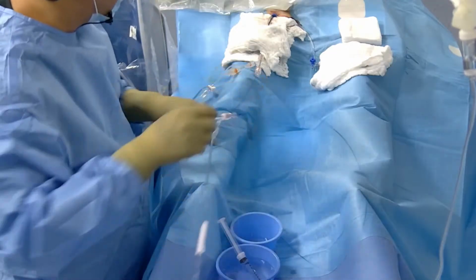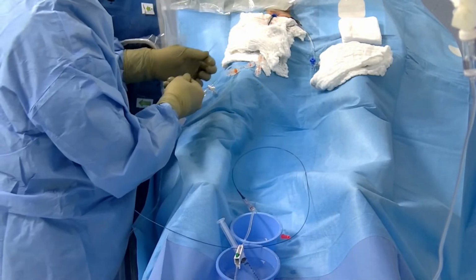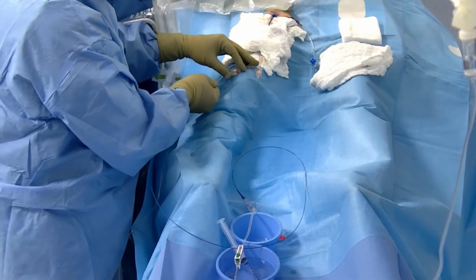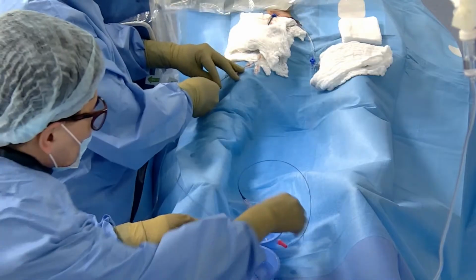Okay. This is for coiling. Coiling catheter we will place on the second. 3.25.